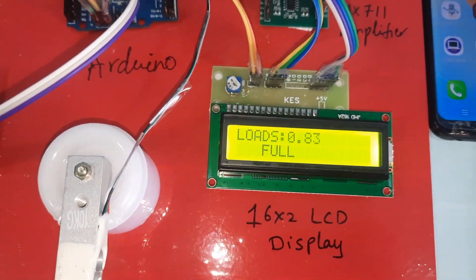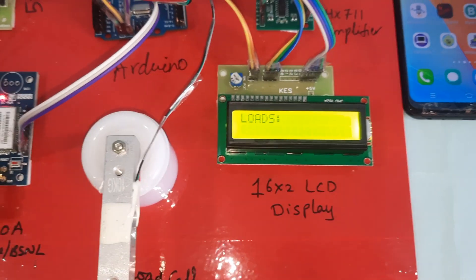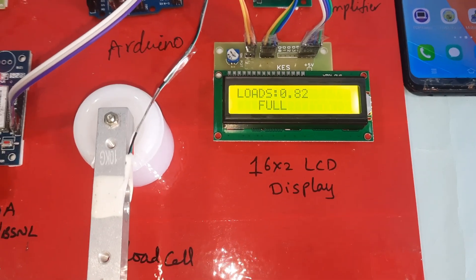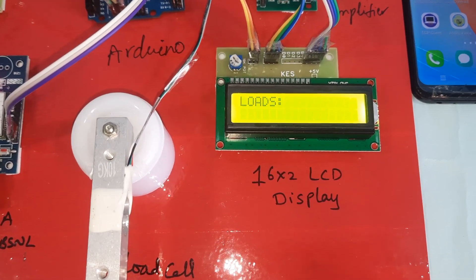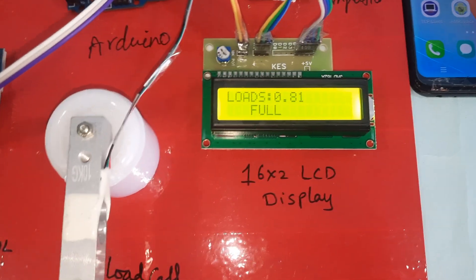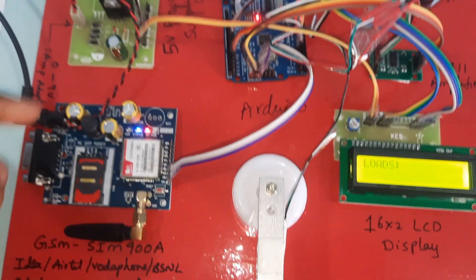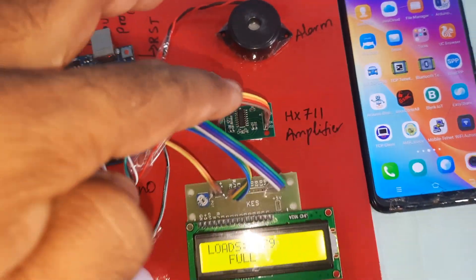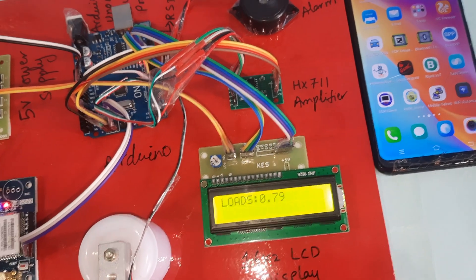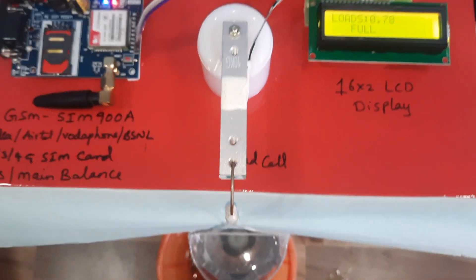Reading is 0.83 — full. When the level comes to 60 it is mid, 30 and below is low, and below 30 we get the SMS alert. Components used: GSM module, power supply board, Arduino Uno R3, alarm, HX711 amplifier, 16x2 LCD display, and load cell.